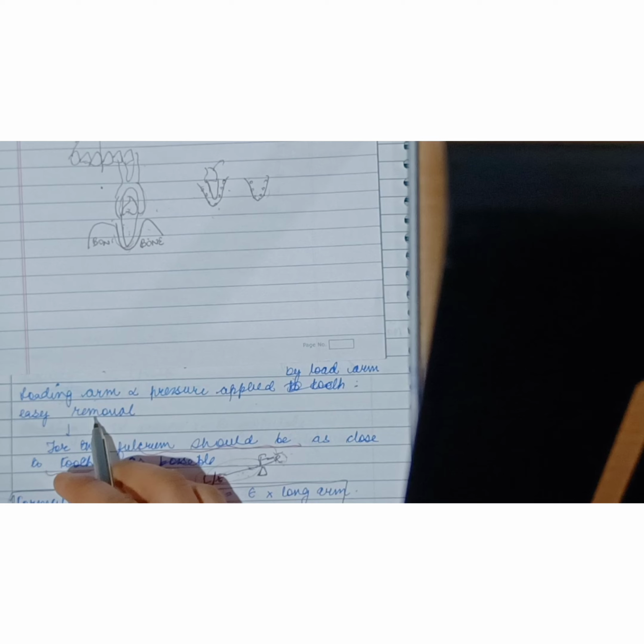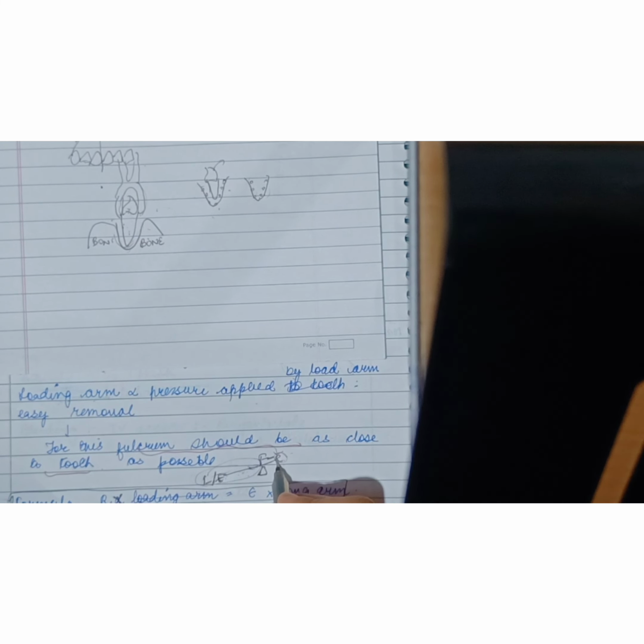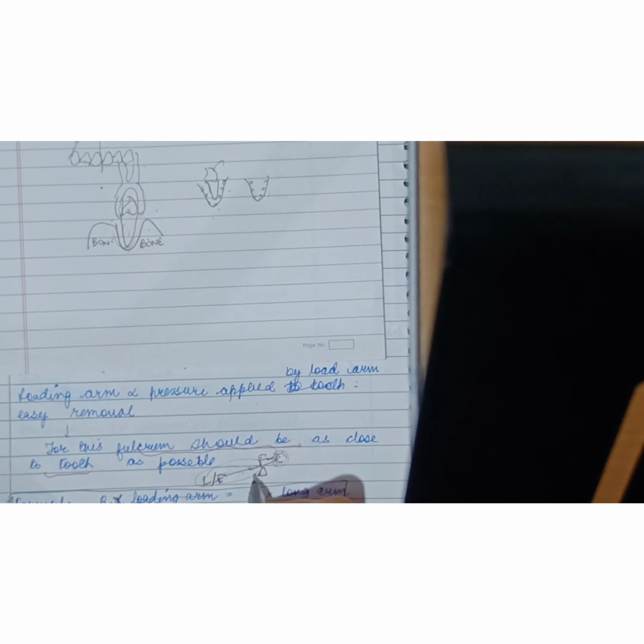Therefore, for easy removal, since more pressure will be applied, the tooth will be removed easily. Therefore, for easy removal, the fulcrum should be as close to the tooth as possible. Our resistance, we saw that resistance is the tooth. So the fulcrum should be as close to the tooth as possible for easy removal.